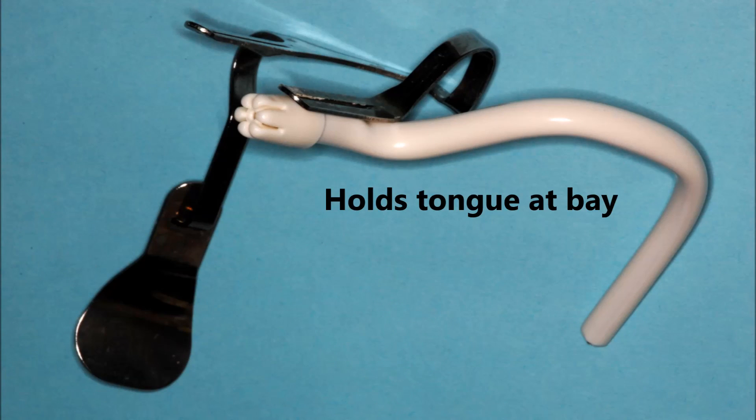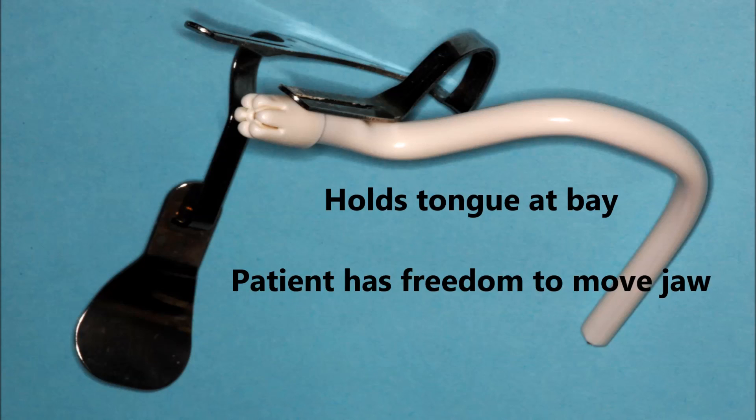In summary, the Garmer's saliva ejector setup holds the tongue at bay — easier on both you and the assistant. An extra precaution to prevent the tongue from jumping into the operative field. The patient has freedom to move their jaw and is not locked open by a bite block. And finally, the Garmers provides access to the operative field.